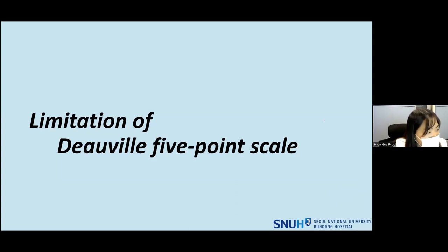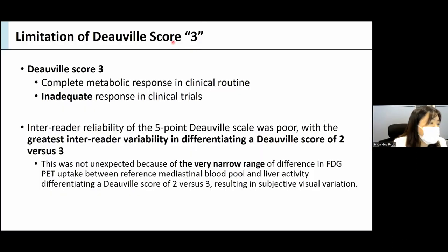So I would like to introduce the limitation of the Deauville score 3. Usually the Deauville score 3 is a complete metabolic response in clinical routine.